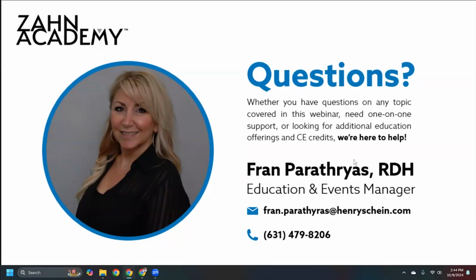All right. How often do you calibrate your printer? So with the Asiga line, calibration is pretty easy. Zero calibration only takes a couple of minutes. So I do it anytime I start a new print job with a different material than I just printed. If I'm printing the same material consistently, then I do it once per week.